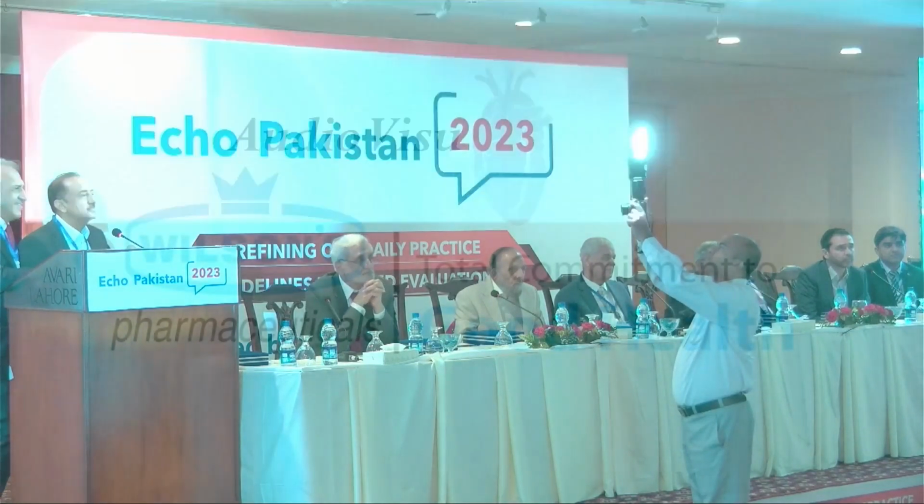There may be another possibility that the size of the patient may grow, the body surface area may increase, the obesity may increase. So that may also lead to patient prosthesis mismatch later in life. Yeah. So this is another possibility.